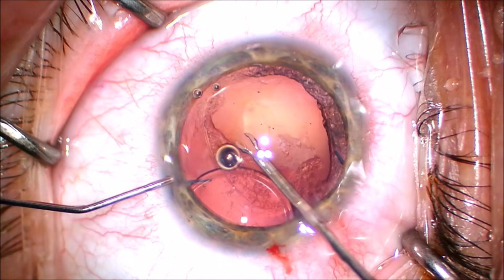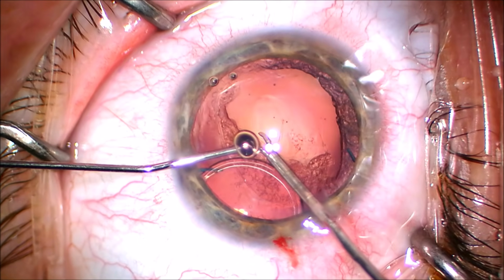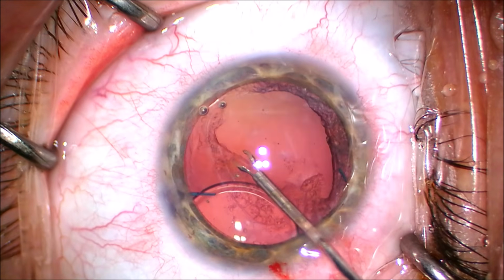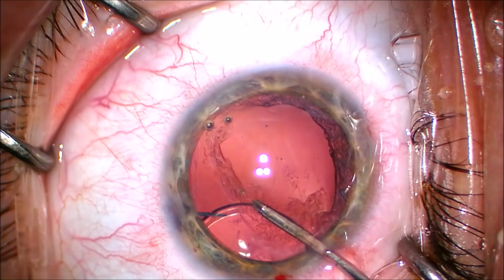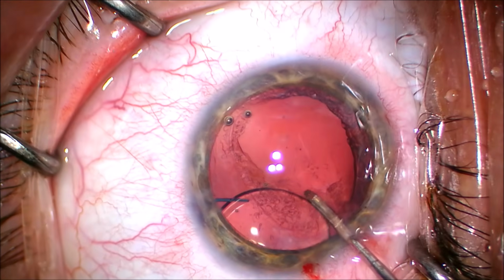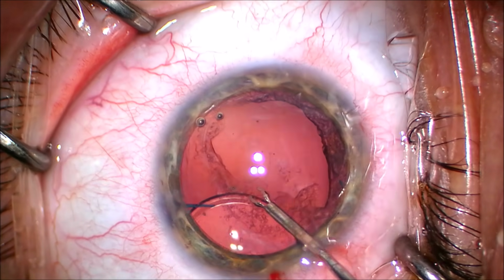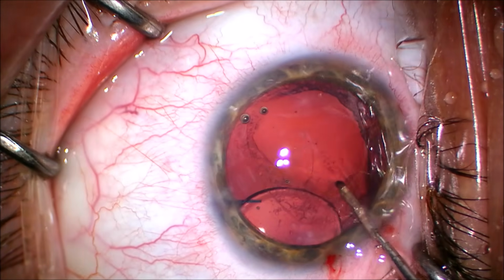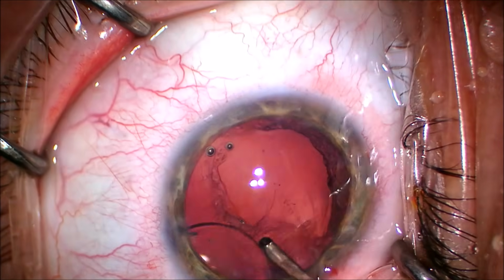Get rid of that bubble. And remember, the posterior capsule is much, much thinner than the anterior capsule. So doing a rhexis with the posterior capsule is a little bit more tricky and a higher risk for runout. So I'm going very slowly all across. I've gotten about 1/4 of the rhexis completed.